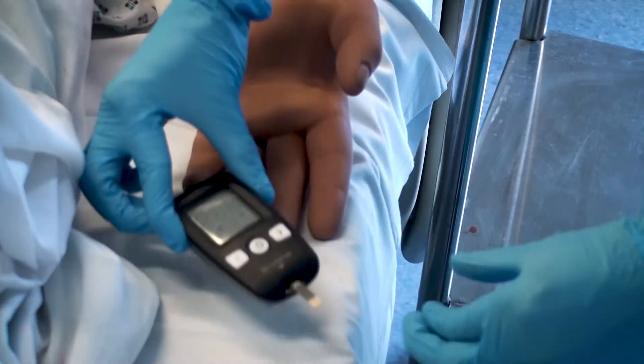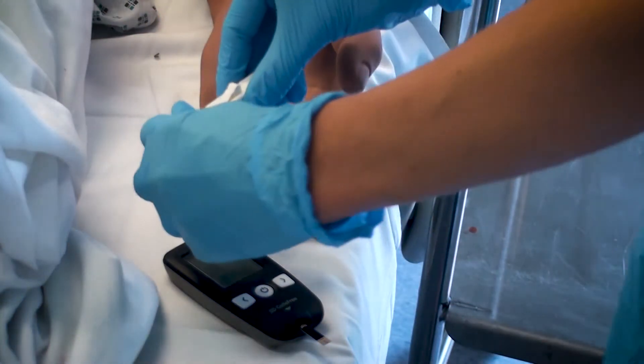Place the test strip in the meter and prime the lancet.